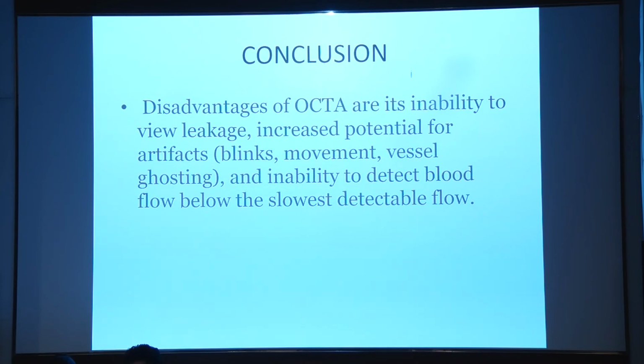Another disadvantage being the inability to view the leakage which is happening from the vasculature, and there's increased potential for artifacts, which is reducing now as the software is being upgraded. This tool has been there now for almost 6 to 7 years, and the amount of artifacts are reducing now with the increase in the speed of the A scans and refinement in the software.